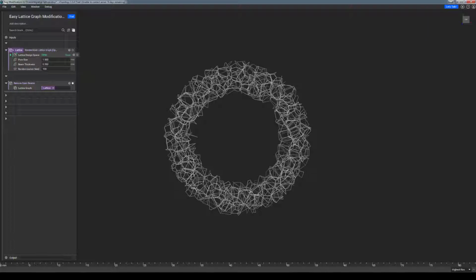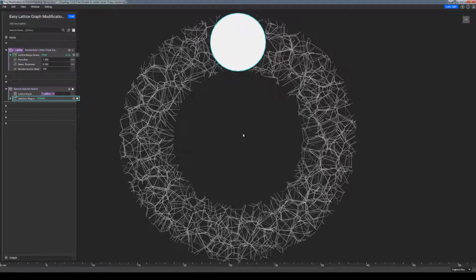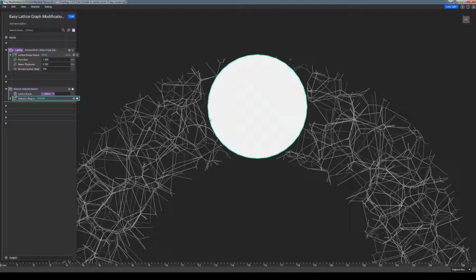In the case where a user wants to be more selective, there is a custom block available called Remove Selected Beams. With this block, a user can use another implicit body as a selection region to designate which beams they would like to remove. Although this may appear to be a trim, keep in mind that this works a little bit differently than a trim in that it will not trim or truncate a beam, but rather if any part of the beam falls within the selection region, the entire beam will be removed.